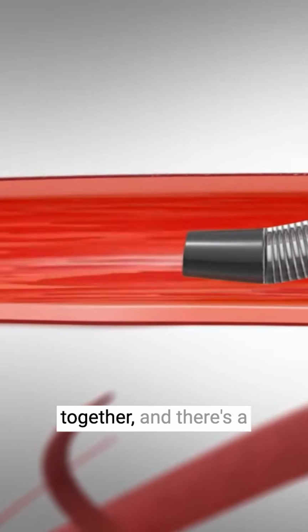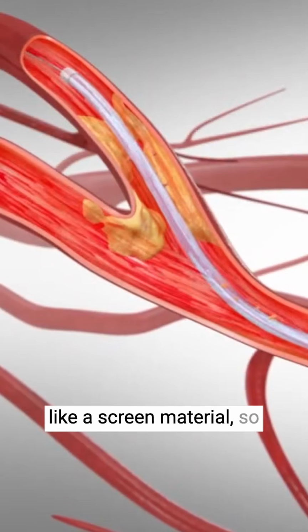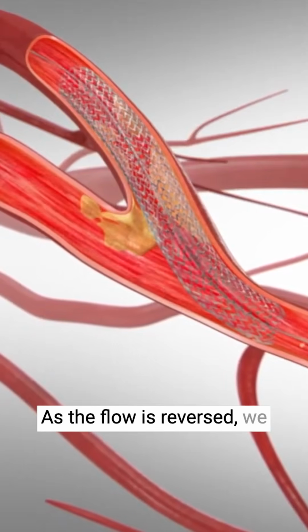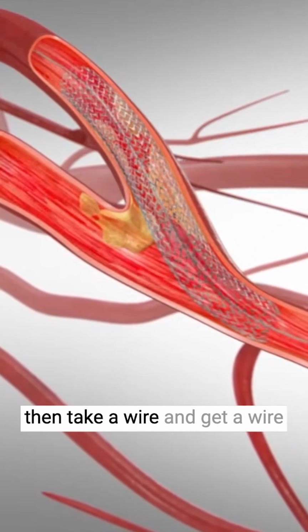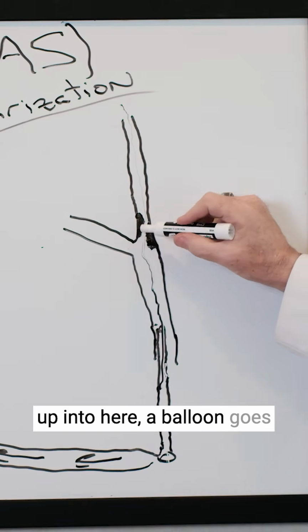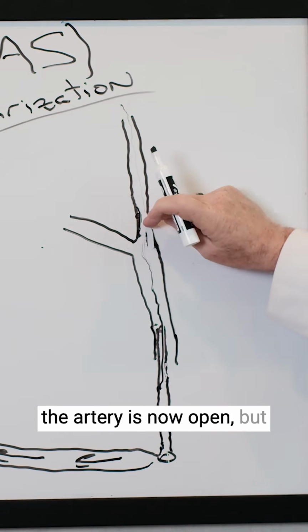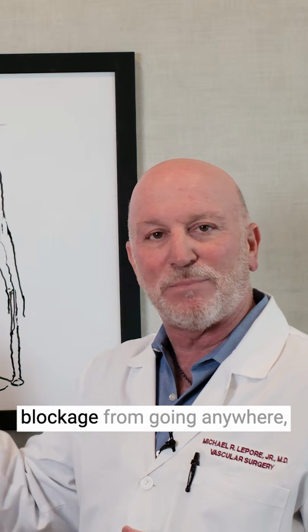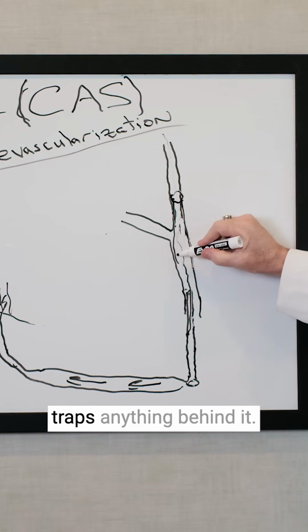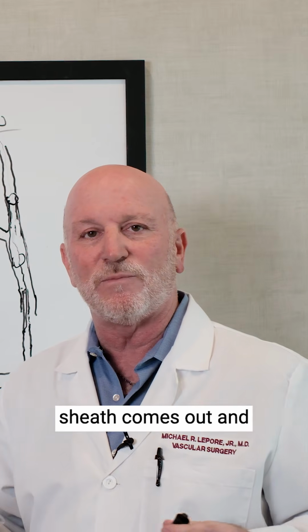We hook these two tubes together, and there's a trap right in between in the whole circuit that's like a screen material, so it captures anything, and then the flow gets reversed. As the flow's reversed, we then take a wire and get a wire up through this blockage and up into here. A balloon goes up and opens up this so that the artery is now open, but the artery may not stay open, and you want to protect that blockage from going anywhere. So then we deliver a stent that goes like this and traps anything behind it. This comes out, the artery gets closed, and then the sheath comes out and pressure is held at the groin.